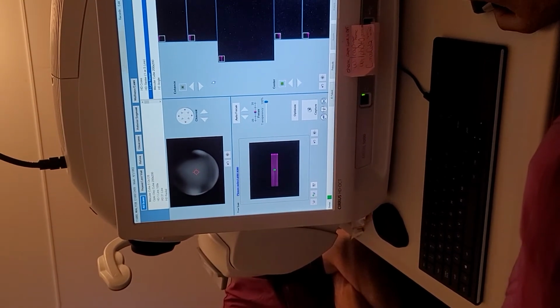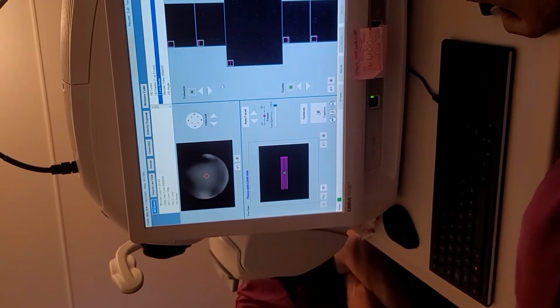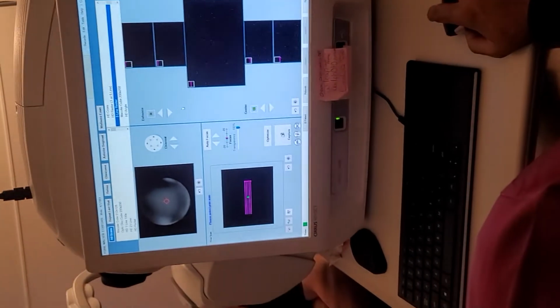You might not remember that you did it if you went to the macula and then didn't take the 5-line, and then the test goes over to the doctor and the doctor says you didn't get the 5-line raster, and the patient's been out there waiting. Now you have to bring them back and get the next image. It takes time away from the clinic, from you working up another patient, and from the doctor's time. So make sure that you do it in a sequential order that you remember, and that you get what's needed for the doctor.